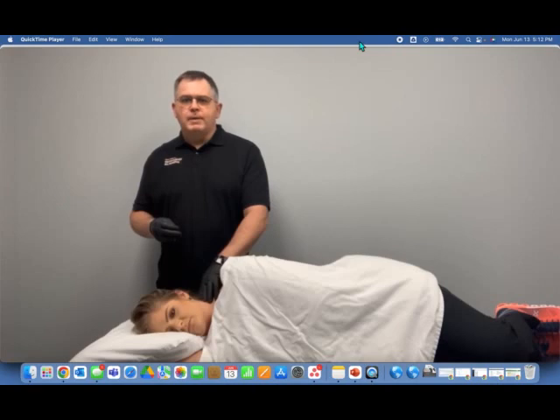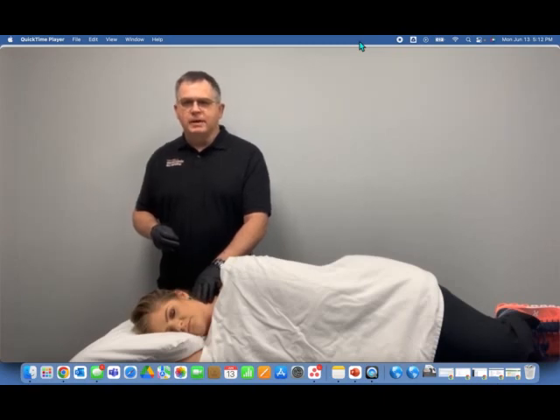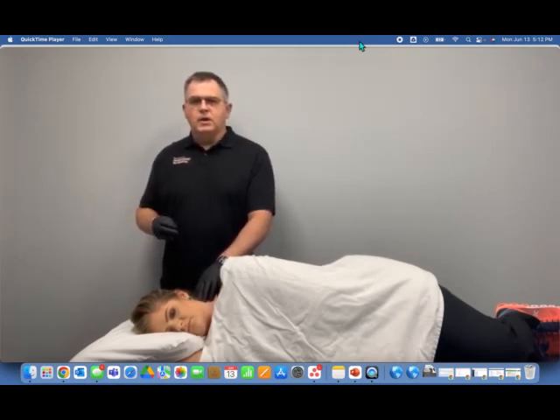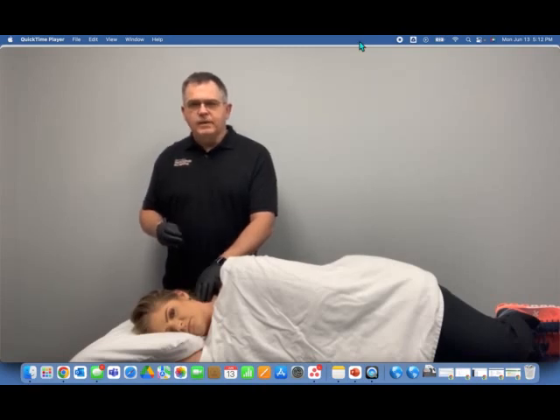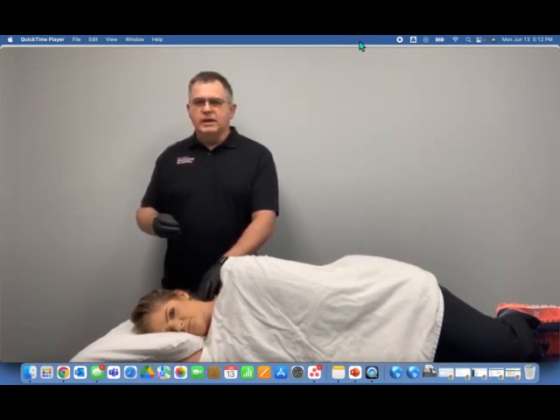For this, we're going to palpate midway between the clavicle and the mandible. For the articular pillar, you should be able to differentiate between the pillar and the transverse process, which will sit more anterior. We're going to note the anterior and posterior drop off. We're going to needle at C4 or C5, direct perpendicular to the articular pillar, lateral to medial, with a 10 to 15 degree anterior to posterior angulation to avoid the brachial plexus and the vascular structures.